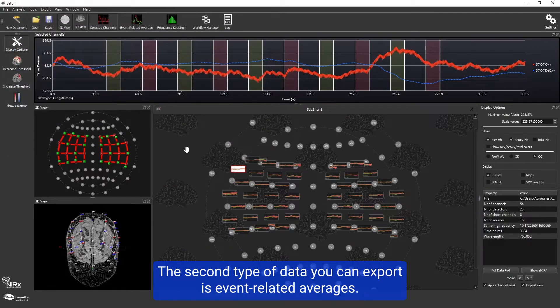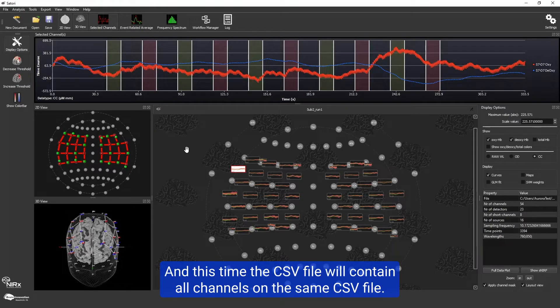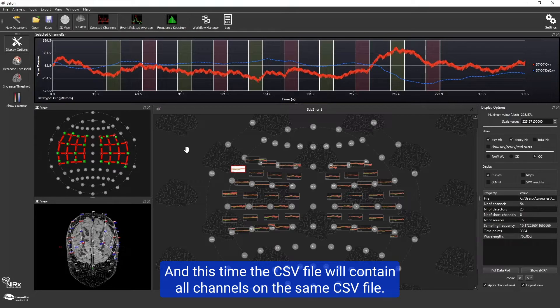The second type of data you can export is event-related averages, and this time the CSV file will contain all channels on the same file.